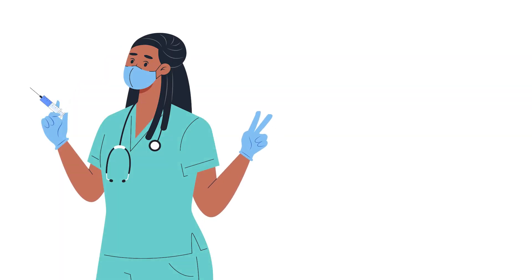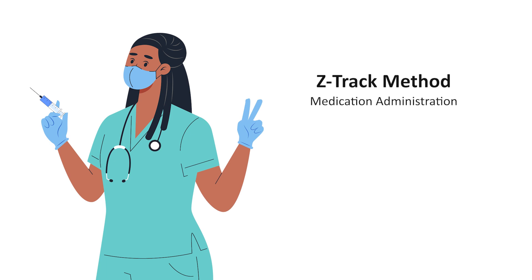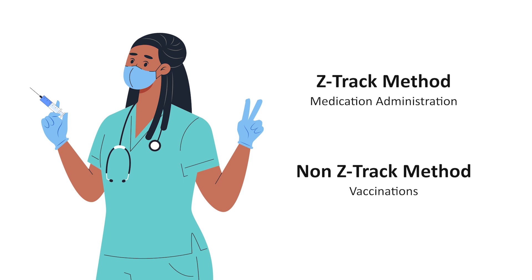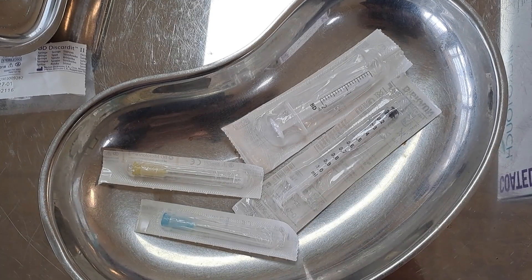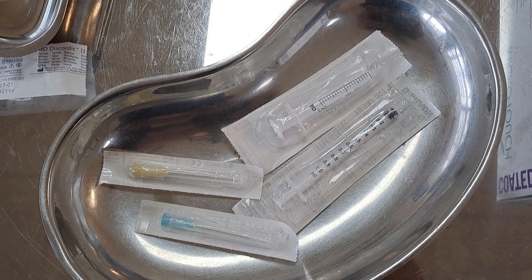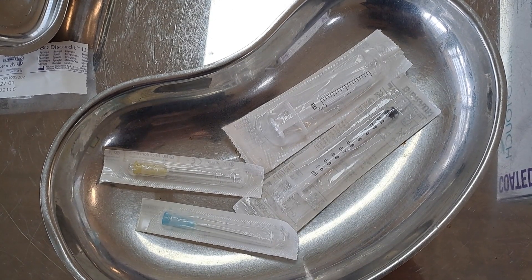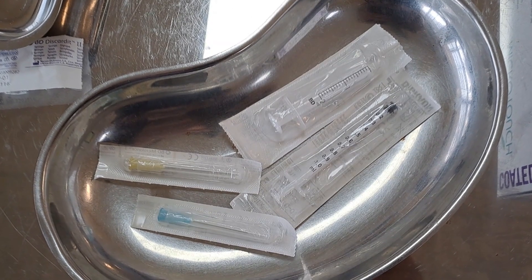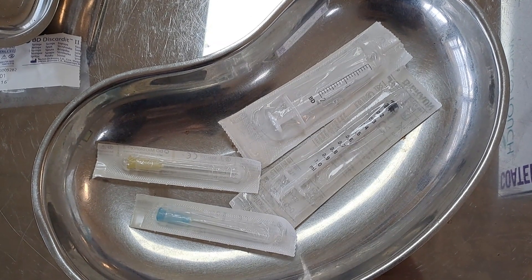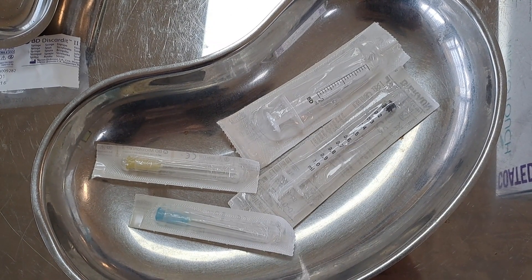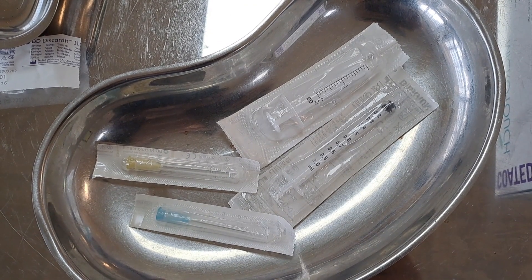There are two methods that can be used: the Z-Track method for medication administration and the non-Z-Track method for vaccinations. But before we begin, remove the cover from the needle and assess the needle head using a non-touch technique to detect any faulty equipment.